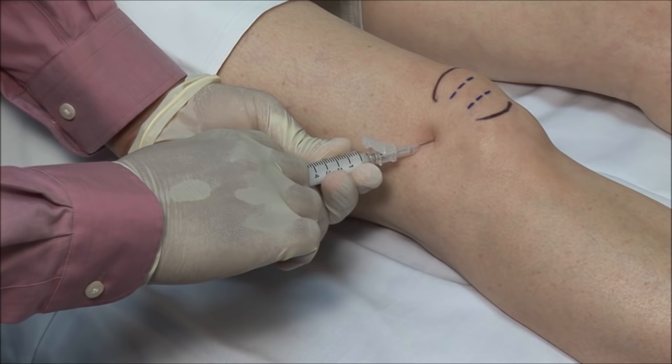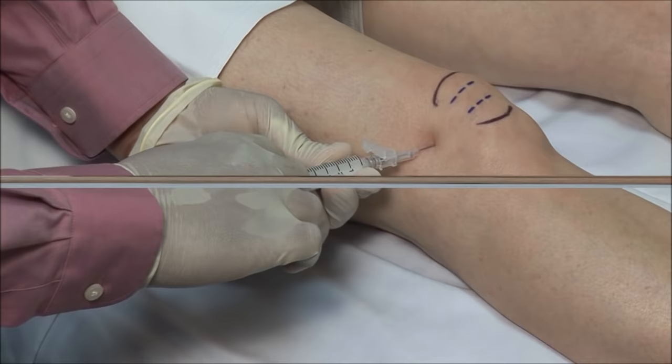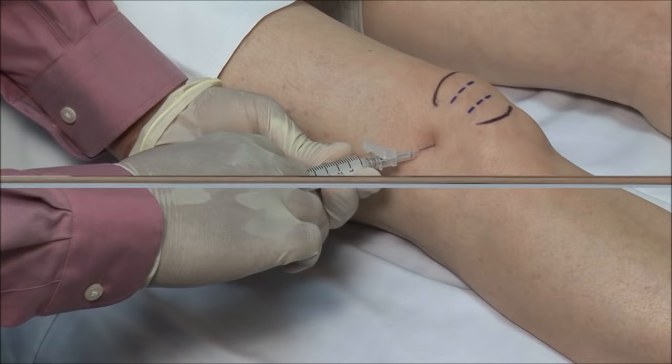This should go in freely. If there is any resistance, then withdraw and adjust the needle accordingly. Finish off by drying the site and applying a bandage.